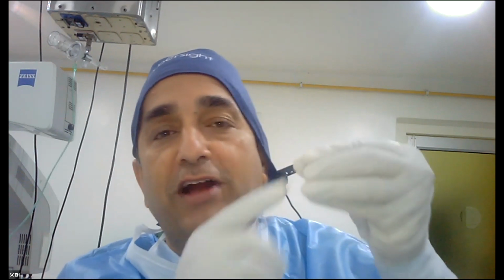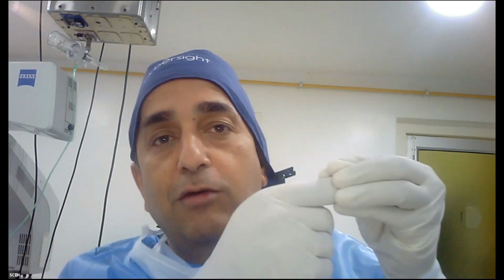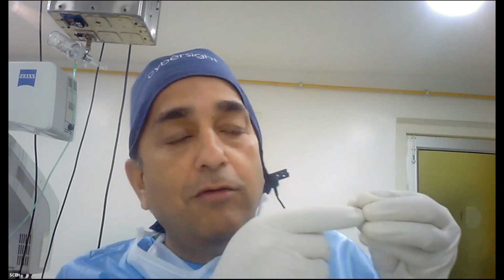If it's a soft cataract, you have to use very little energy, otherwise you go through and through. But if it's a hardish cataract, you can, and also try to do it towards the middle of the piece or below. Don't be too superficial. So you hold the piece where there's meat in the piece. With a little burst of phaco, you go in step 3.